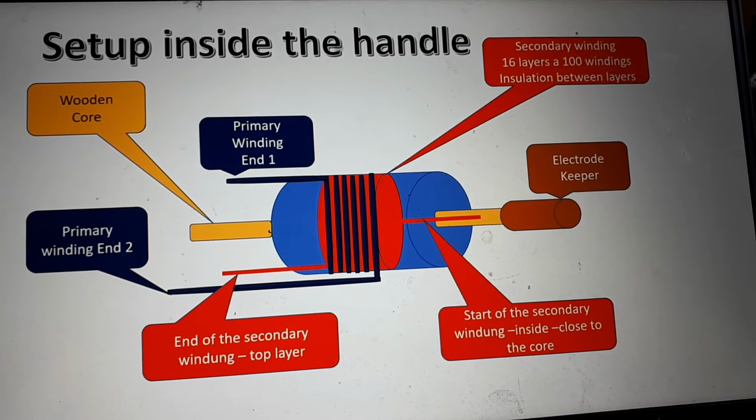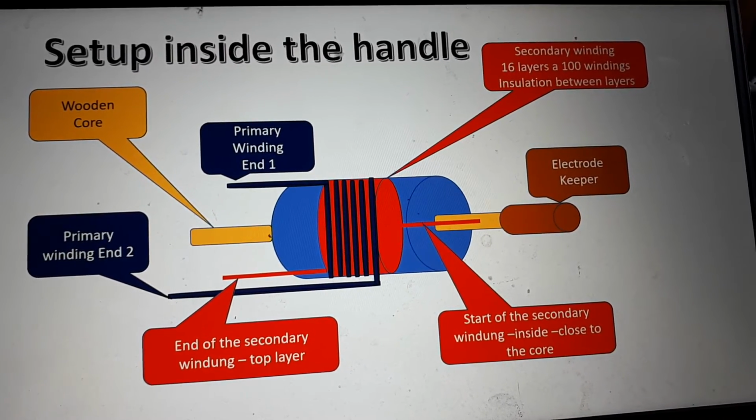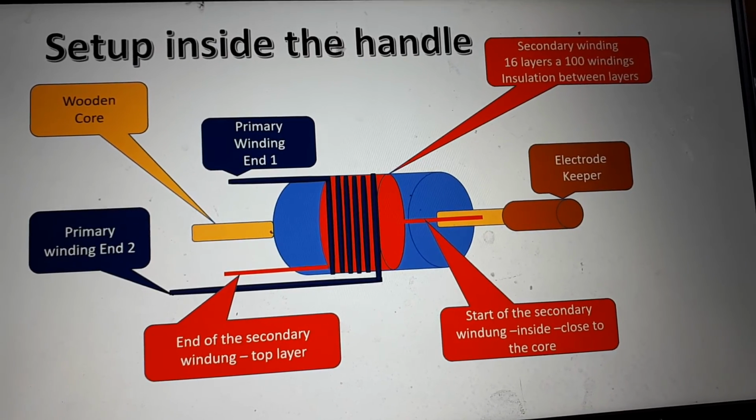So this is the critical problem that we can have, where the thin wire is damaged somewhere inside of these 16 layers. And normally we throw these coils away.